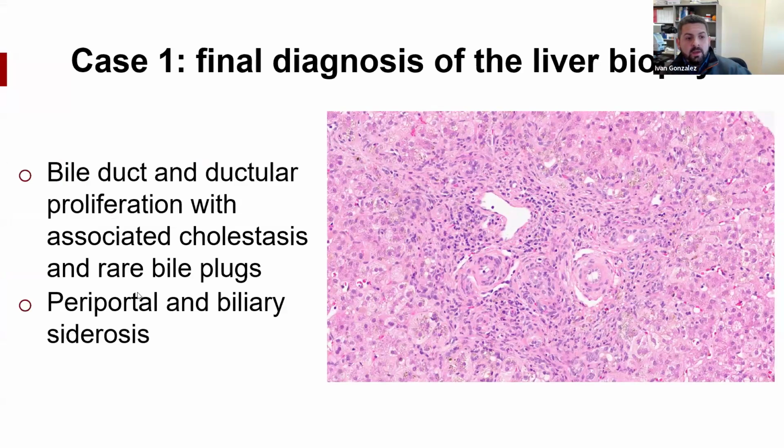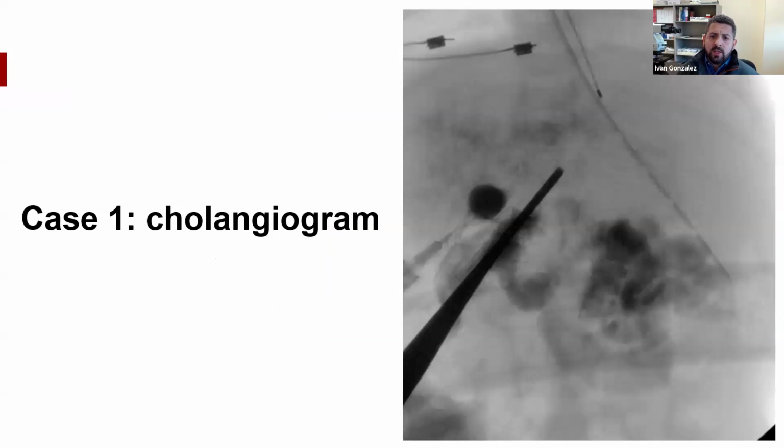These iron depositions, in my opinion, when you have them more dense in the periportal area with that gradient, it's usually physiologic iron. Especially in these kids very early on, they're doing a lot of extramedullary hematopoiesis in the portal tracts, so there's going to be more iron depositing in this area. Of course, I put that in my report, but I say I cannot exclude an iron disorder.